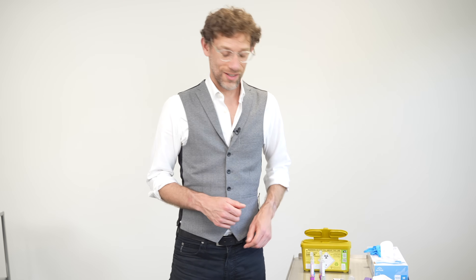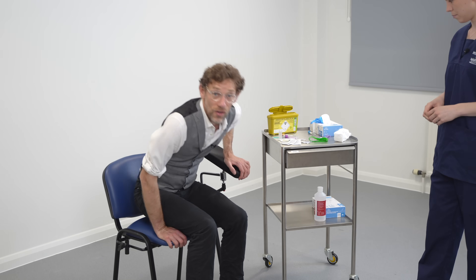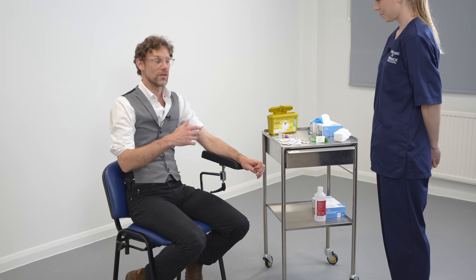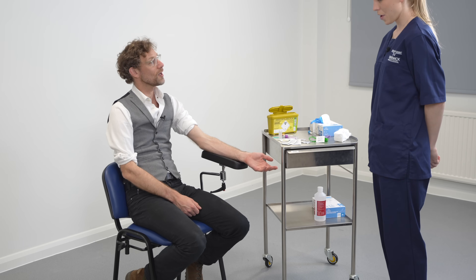Let's swap over — it's time for me to sit in the hot seat. So my turn in the hot seat. We've got Megan doing the examination, and Megan's going to run through the whole venipuncture as if we're doing that live on the ward.